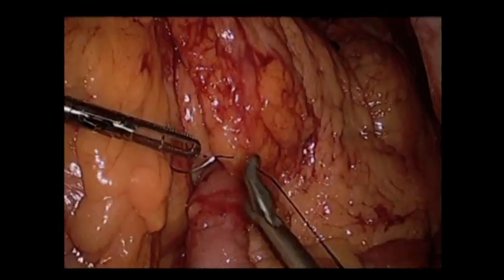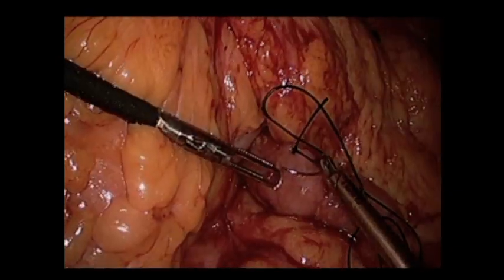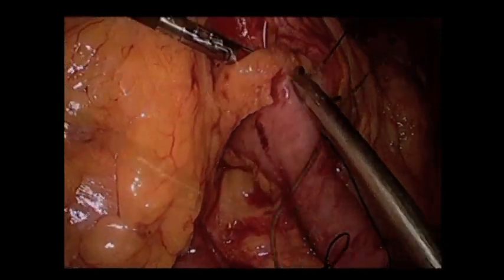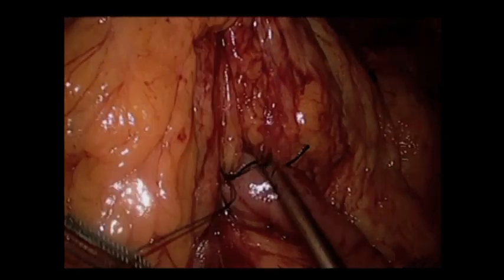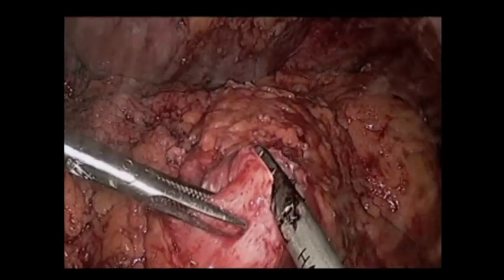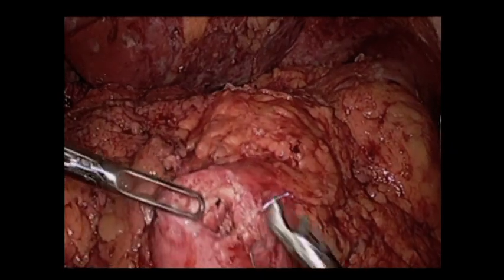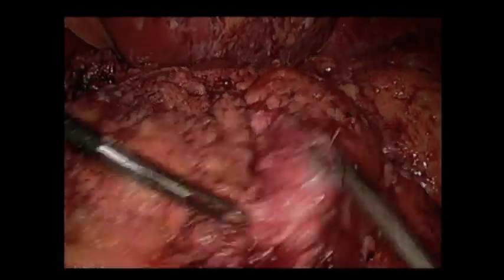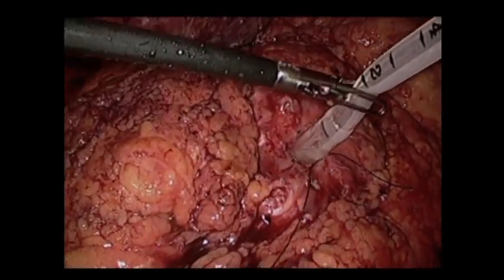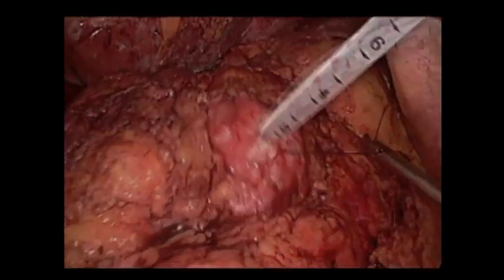The transverse mesocolic defect is closed around the retrocolic Roux limb. A gastrotomy is made in the gastric remnant — we routinely put in gastrostomy tubes in our revisions with a purse-string suture. The specimen is taken out, and a gastrostomy tube is placed and secured. Finally, we leave a drain by the anastomosis.